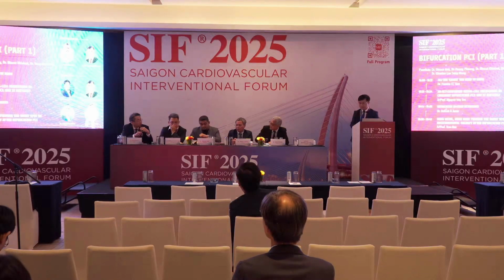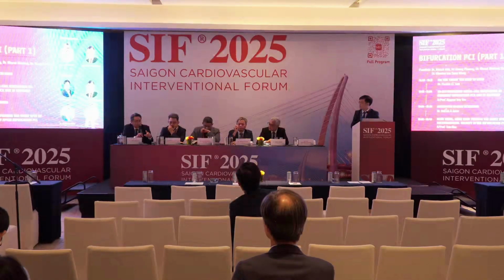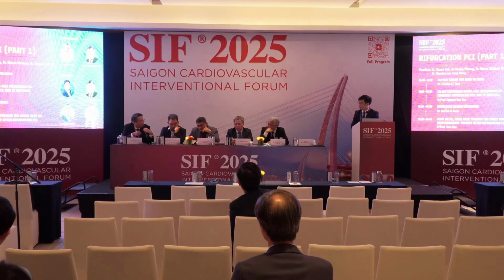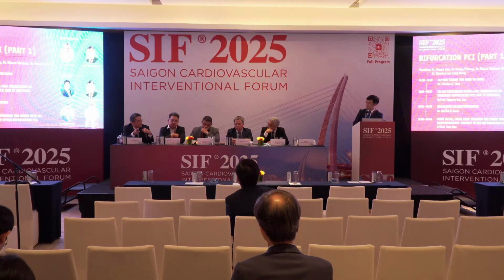Thank you for your presentation. Actually, I really love the OCT guided PCI. In the past I loved 3D wiring to the side branch. After rewiring, I pulled back the OCT to see whether this is distal wiring or proximal wiring. But now I do not do this 3D OCT rewiring, because there is no data for clinical comparison of the clinical outcome, and which is better: distal cell rewiring or proximal cell rewiring.